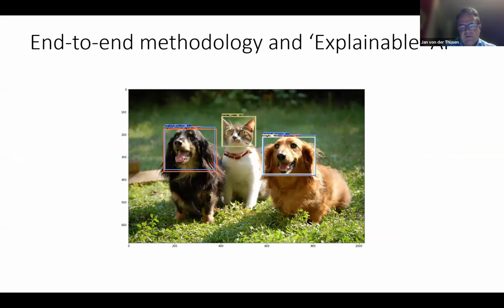So something that Elliot also mentioned, the end-to-end methodology, will also play a role in lung transplant rejection AI, in the sense that if we can just feed the model a large set of data with outcome measures, or at least perhaps orthogonal evidence of rejection, that may lead to more insight into which lesions actually are important, and that we should be looking for.